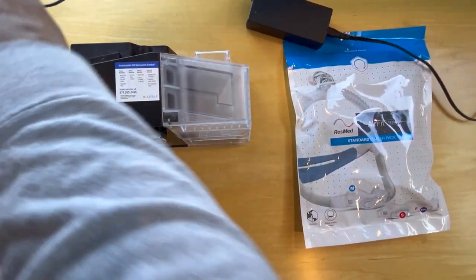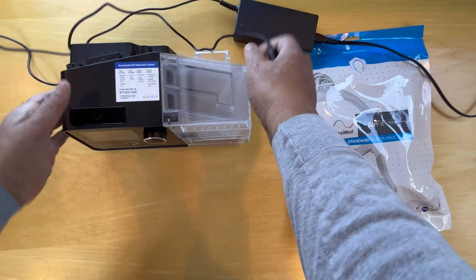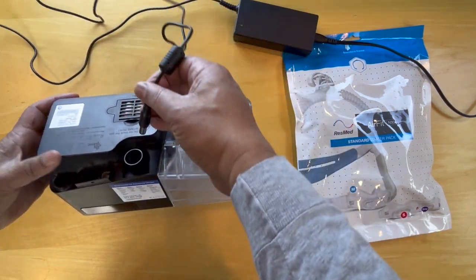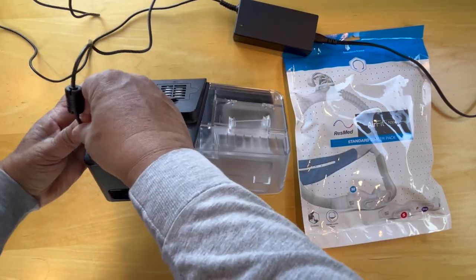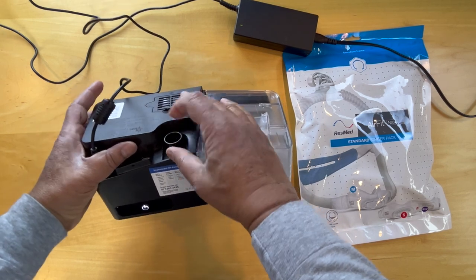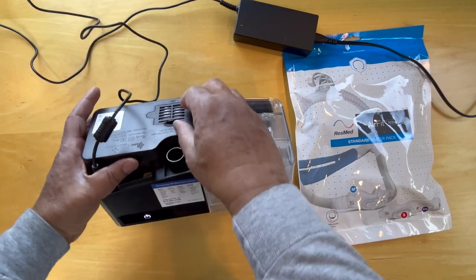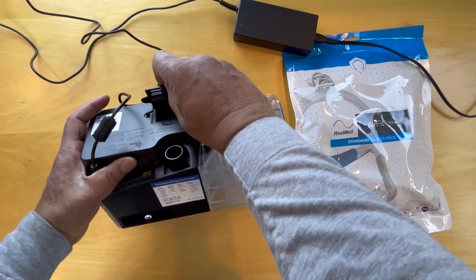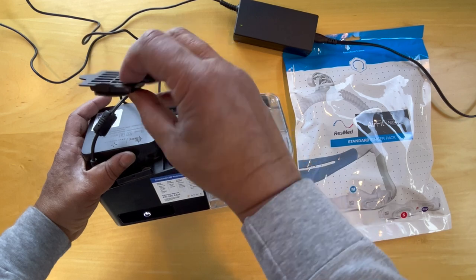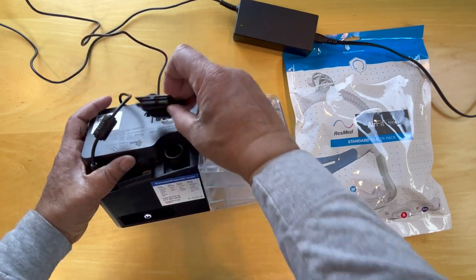Then we plug this in here for power. Hose is here and there's a filter in here. A sponge filter with a cloth filter on the outside.